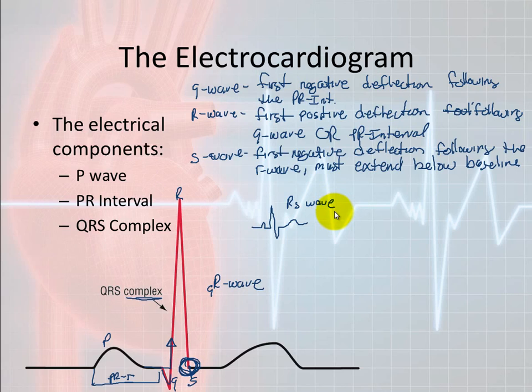They're all considered QRS complexes, but they are not all the same shape. Another thing you could have is a P wave with a very small up and a very big downstroke, and then it comes back up and goes into a T wave. By looking at the definitions up here, this would be an R wave and that would be an S wave, but this would be a little r with a big S wave.